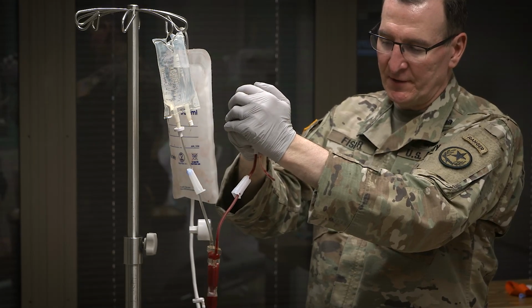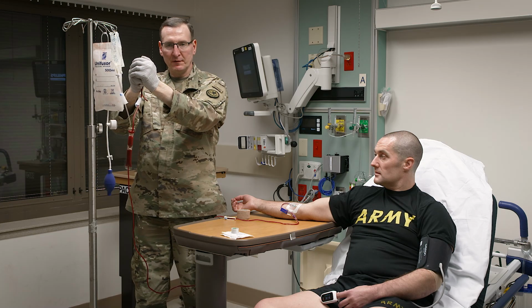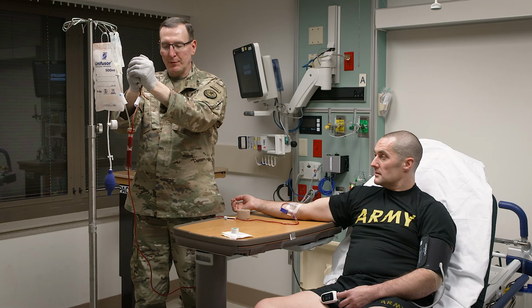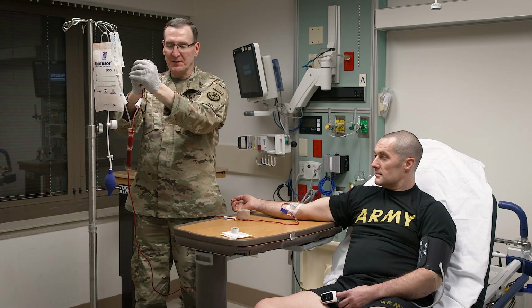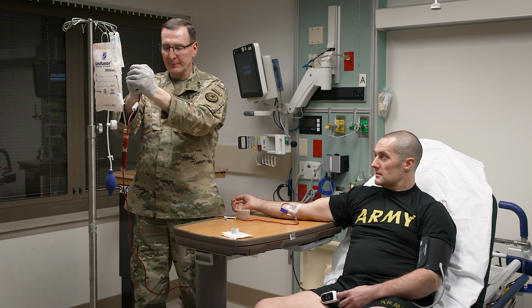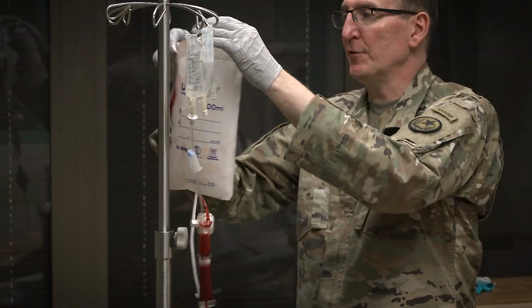Again, don't squeeze it too hard, because you do have the chance of causing damage to the red blood cells and other blood components. So just nice steady pressure. And this goes if you don't have a pressure infuser and you just have to squeeze it manually. Just nice even pressure around the bag. All right, so that concludes our blood transfusion.